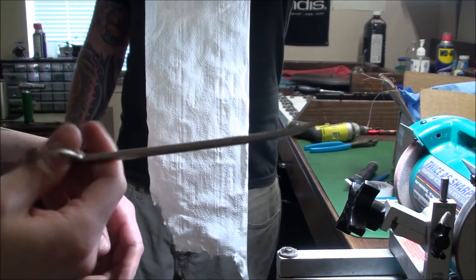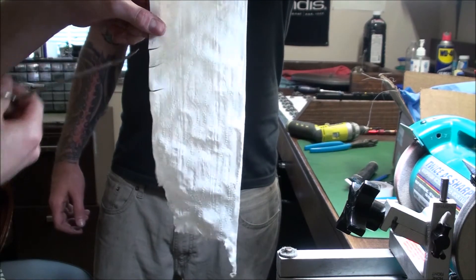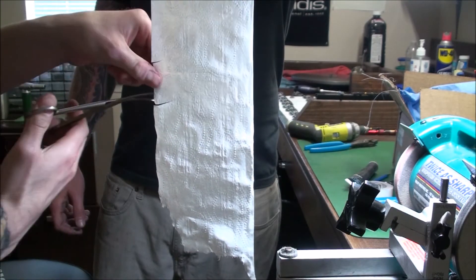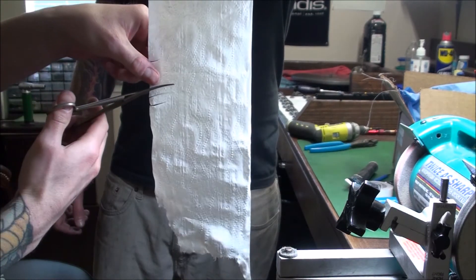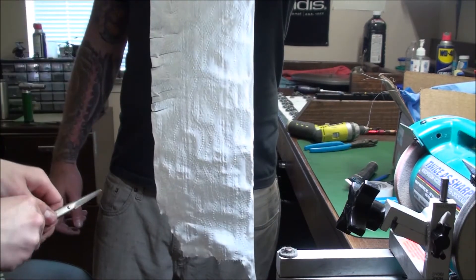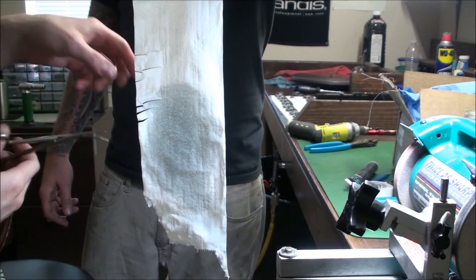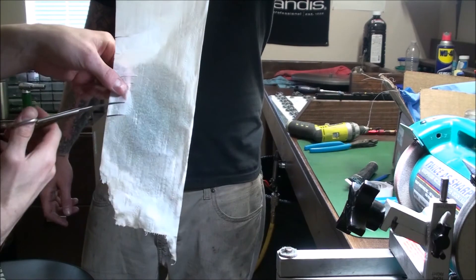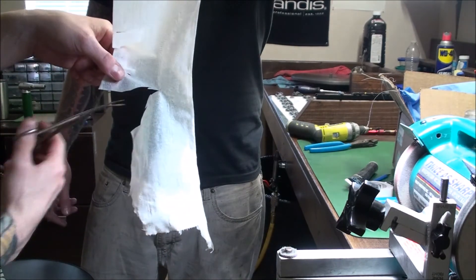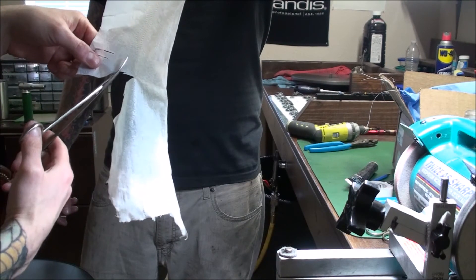Alright, time to test them. Very nice. There you go — surgical scissors cutting wet toilet paper, even though you don't actually cut wet toilet paper.